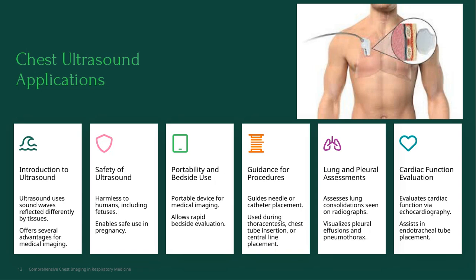Now, let's take a closer look at chest ultrasound applications. One of the key uses is evaluating cardiac function through echocardiography, which allows us to assess how well the heart is working. It's also very helpful for guiding procedures, such as ensuring the correct placement of an endotracheal tube.